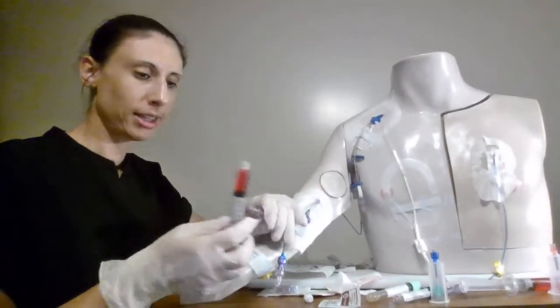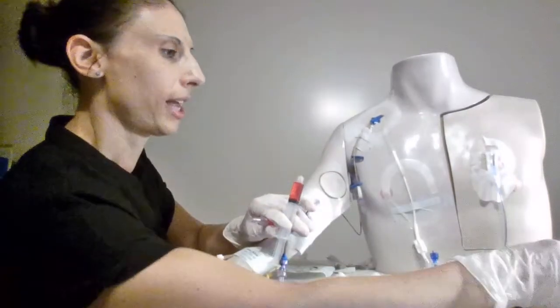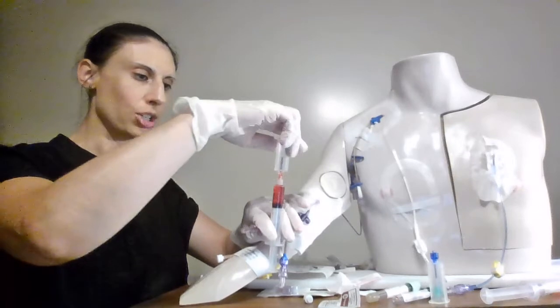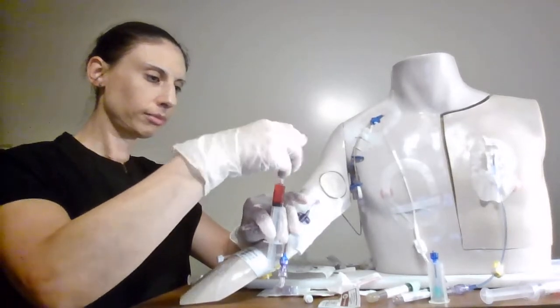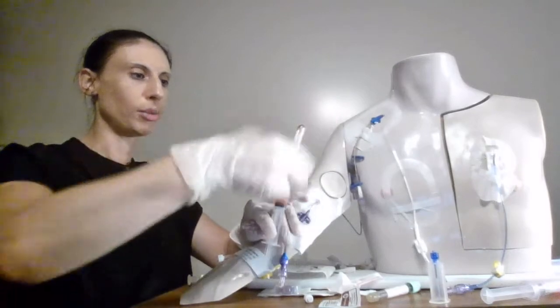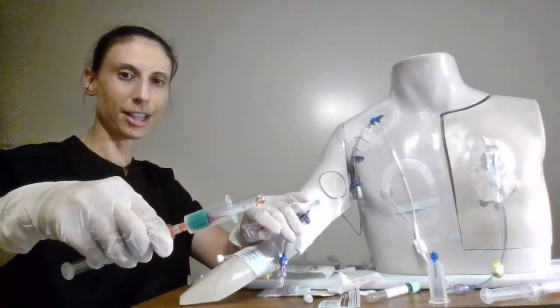Now if I'm using the syringe method I'm going to need to transfer that. So I would take one of these pink cap vacutainers. Attach it to the end. And then I would attach my blood tube onto there. So you can see how that fills a little bit better.